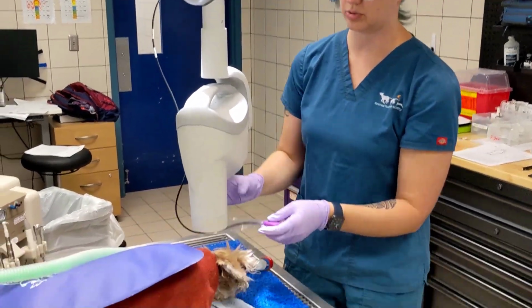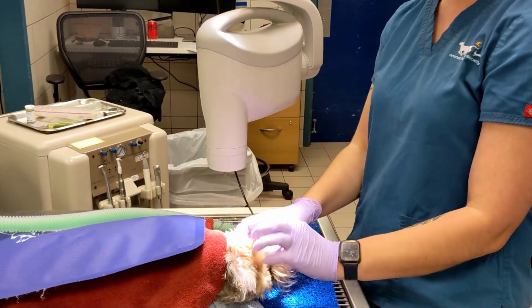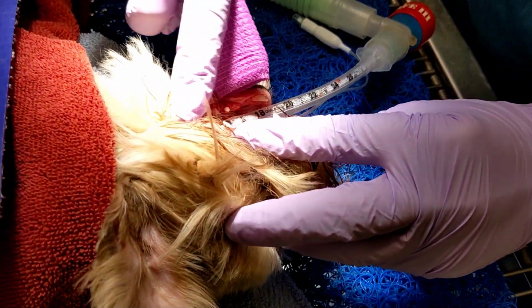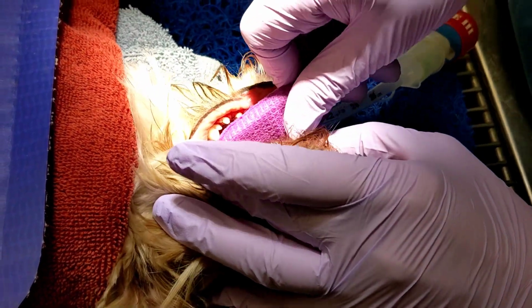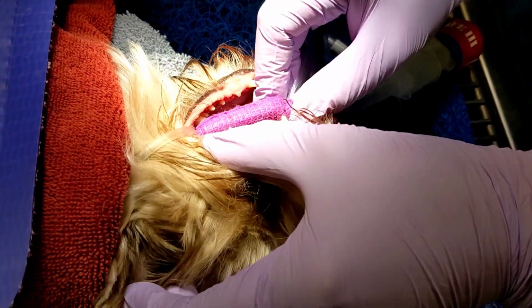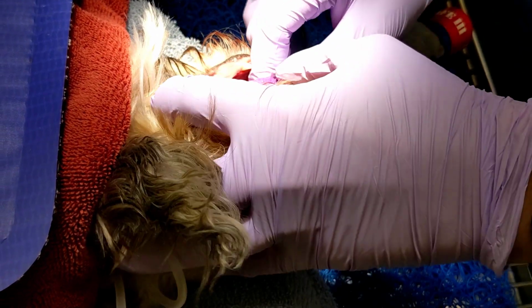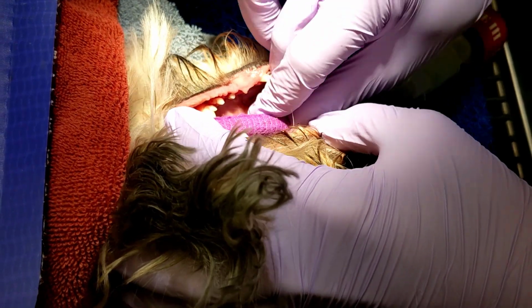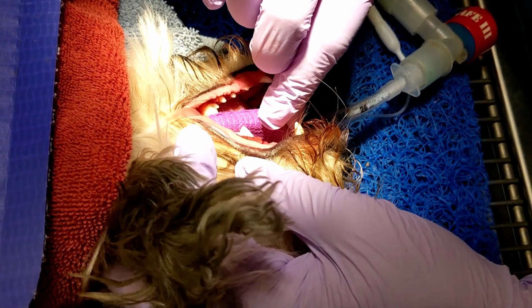So then we have to get this probe in position first. Those teeth correlate with these teeth up here. I've got to stick this probe in flat side up because I'm going to take those upper teeth. I need to get this as far back in the mouth as I can. And I'm aligning the side of that probe with the tips of those teeth because it's the roots that I'm really trying to get.